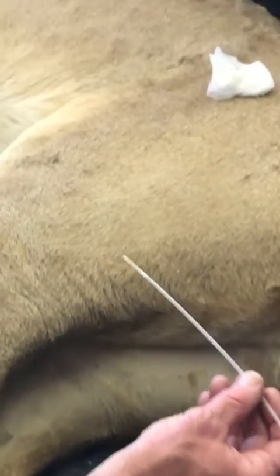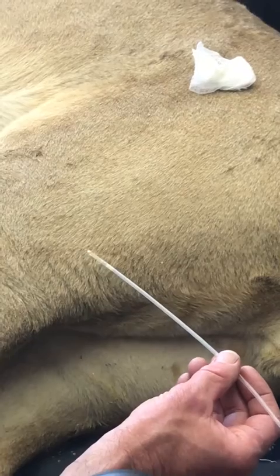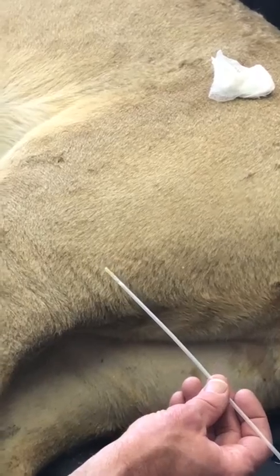That's about a pure concentrate of semen. There's no — or basically includes anything with it — that's just pure semen. That's actually a very good sample. How much would you have, like, a little bit more? About that, a little bit more.